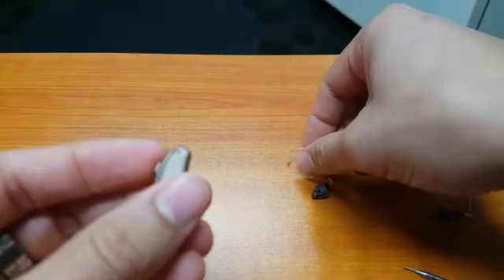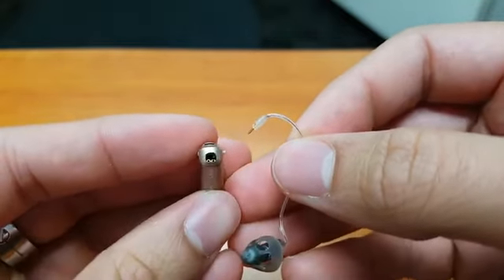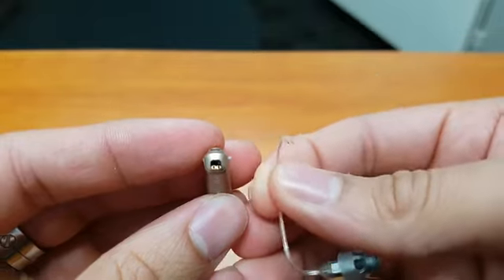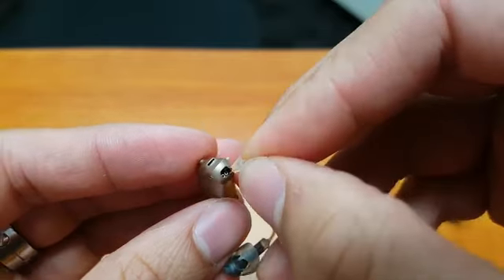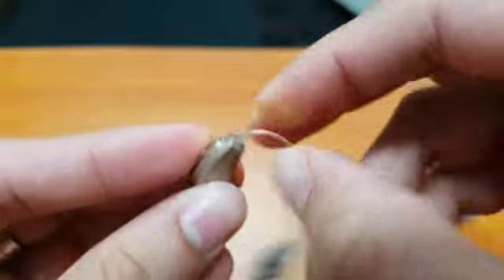Now let's grab the new receiver. Now I'll give you a closer look inside. We've got two holes for the pins. So what you'll need to do is try and match those holes up and push in firmly like so.